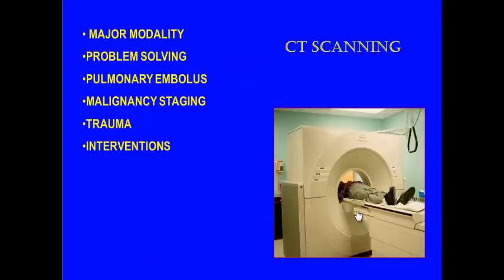That kind of summarizes what we get with x-ray. One of our modalities, certainly a great one to use initially. CT scanning is a great one for follow-up.